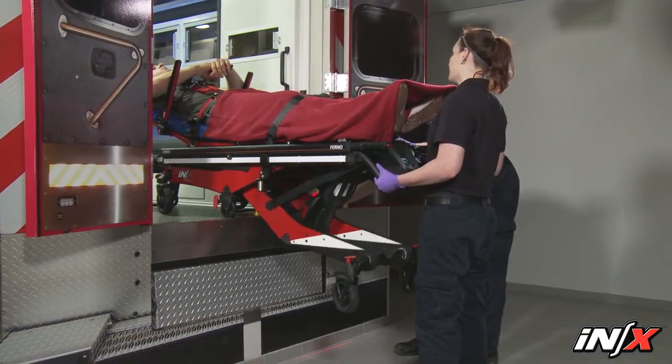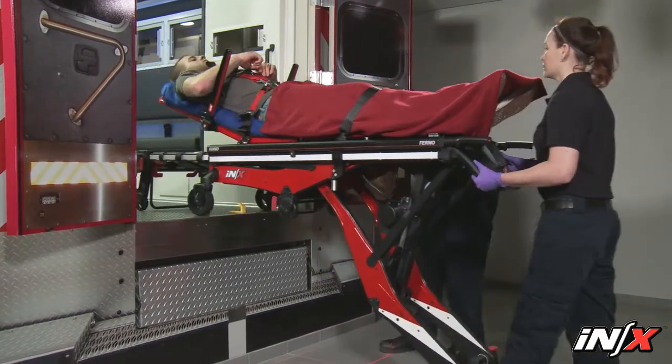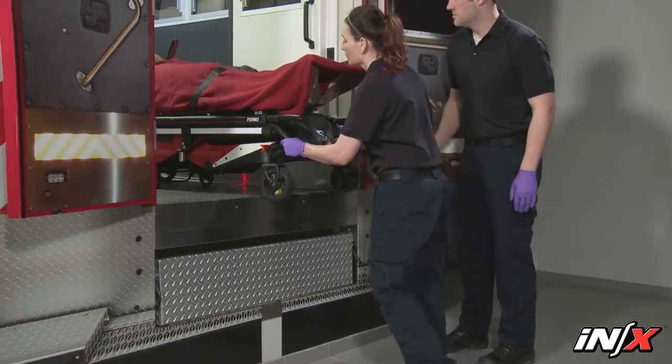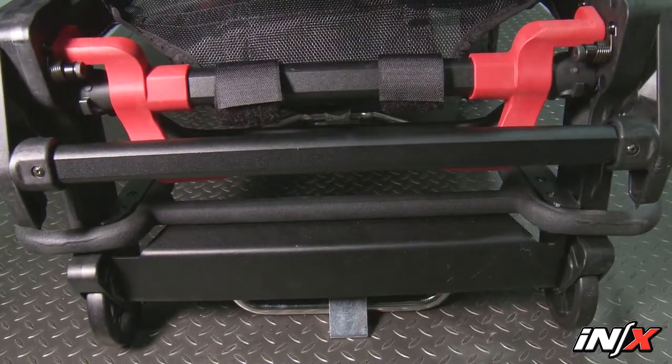The iNX is designed to help reduce the risk of injury to medical service personnel by eliminating or minimizing the amount of lifting required during raising, lowering, or loading into or unloading from an ambulance, and should be used with compatible Ferno fastening systems.